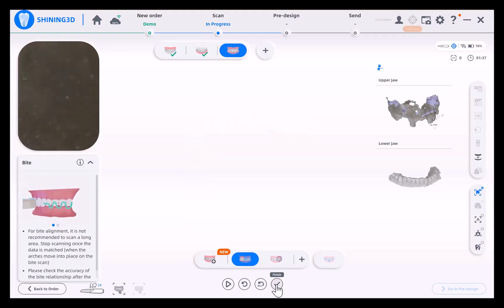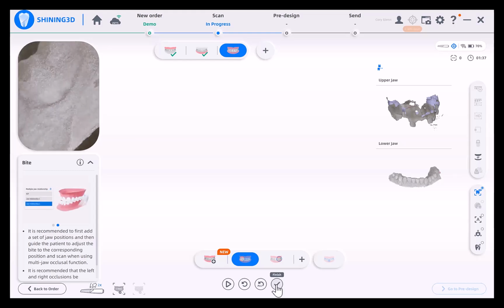And finally, we're going to capture our buccal bite. So we would have the patient bite down. Again, one of the beauties of using a scannable healing abutment is, unlike a long, tall impression post where the patient can't bite into occlusion, you don't even have to remove anything. It's already in place. They can bite down, and so capturing your buccal bite is really simple.